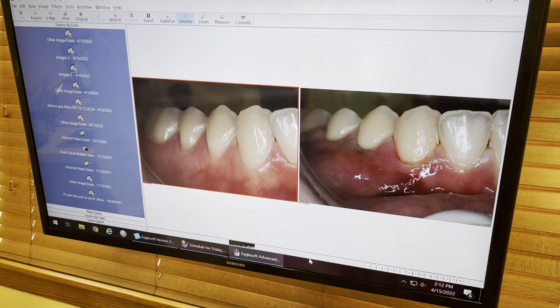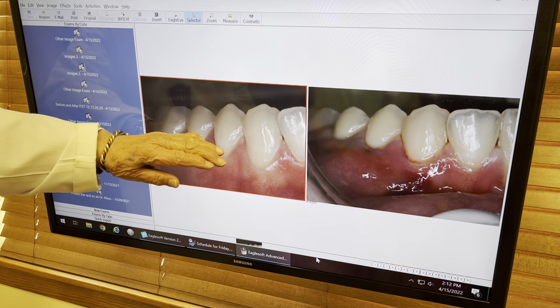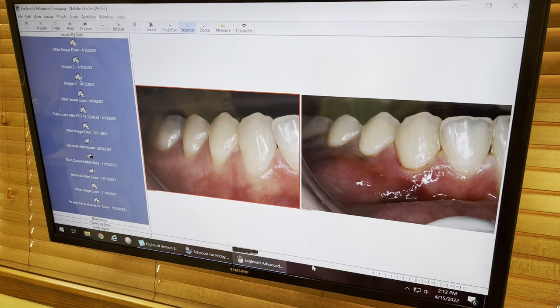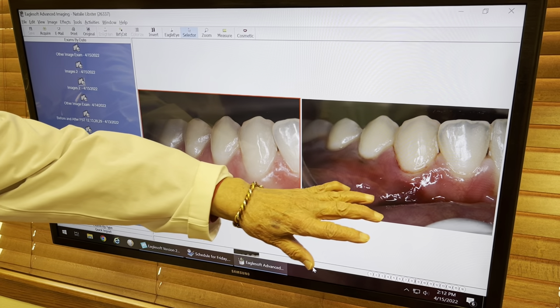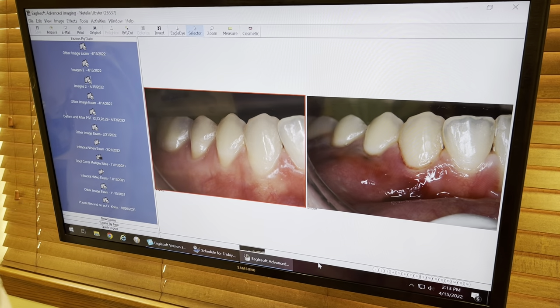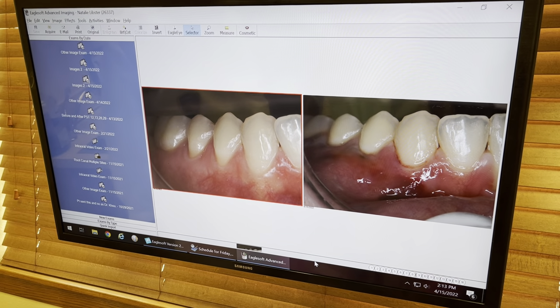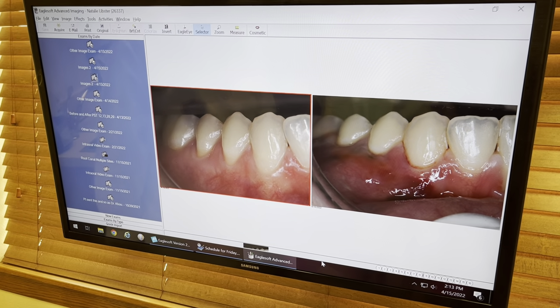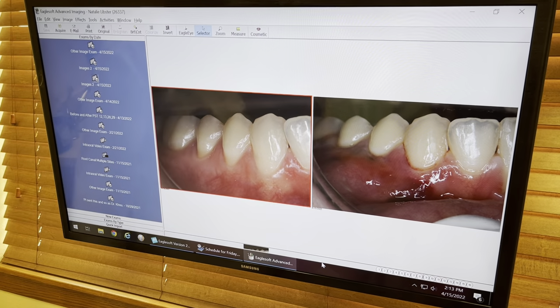We also want to improve the thin biotype here. So in 17 minutes, we raised the gum line, put collagen in, and this is what we get. You can see how it's thicker and it looks like it's swollen, but that's the way it is. We'll be able to get very improved, much improved biotype and with full coverage when we're done.